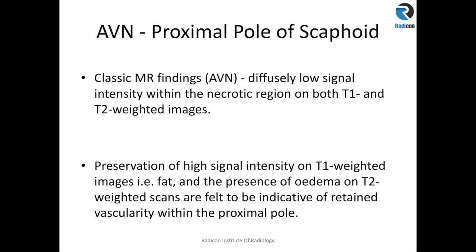If there is preservation of high signal intensity on T1 weighted images — that is fat signal — it usually means that some vascularity is preserved. So the more fat signal is present, the greater the chance that the proximal pole of the scaphoid is viable. As we know, the vascular supply to the scaphoid comes from the distal pole, so the proximal pole is at increased risk of AVN if there is disruption to the vascular structures in the presence of a scaphoid waist fracture.